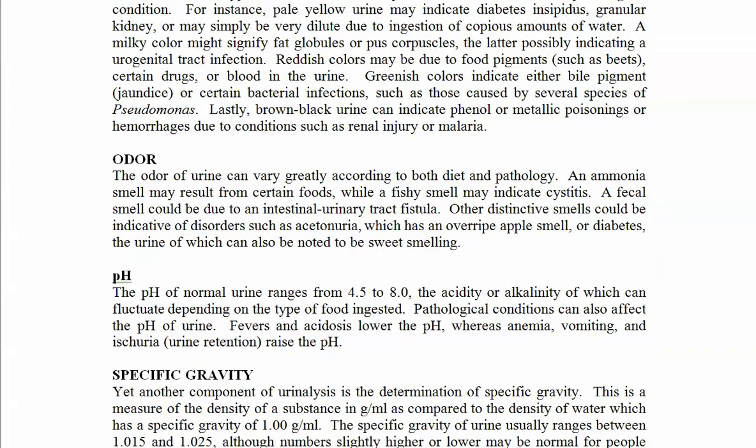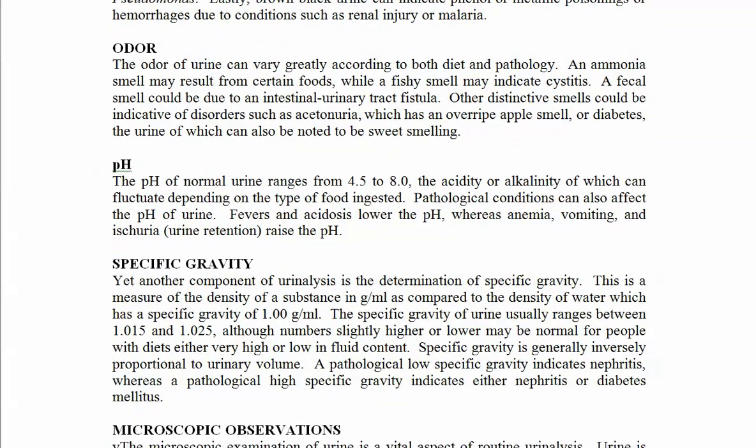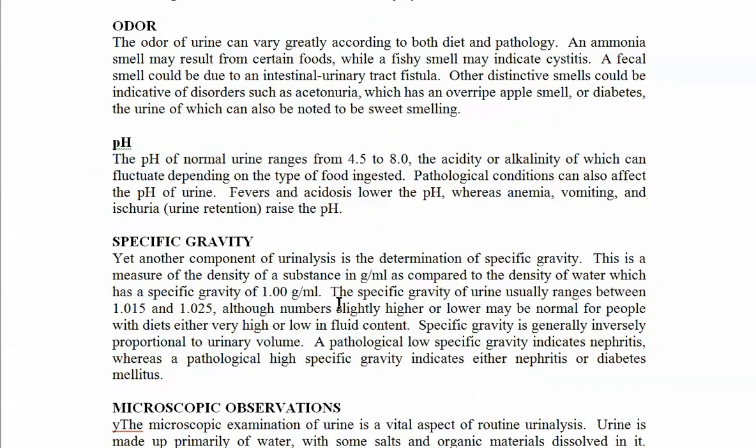The specific gravity needs a urinometer, and specific gravity is simply how dense it is. So specific gravity of 1 is defined to be distilled water at room temperature, or 20 degrees centigrade. So distilled water at 20 degrees centigrade would have a specific gravity of 1. And specific gravity just talks about the density as compared to water. So if you put something that is neutrally buoyant in water, it will have a specific gravity of 1, and it will float within the water.